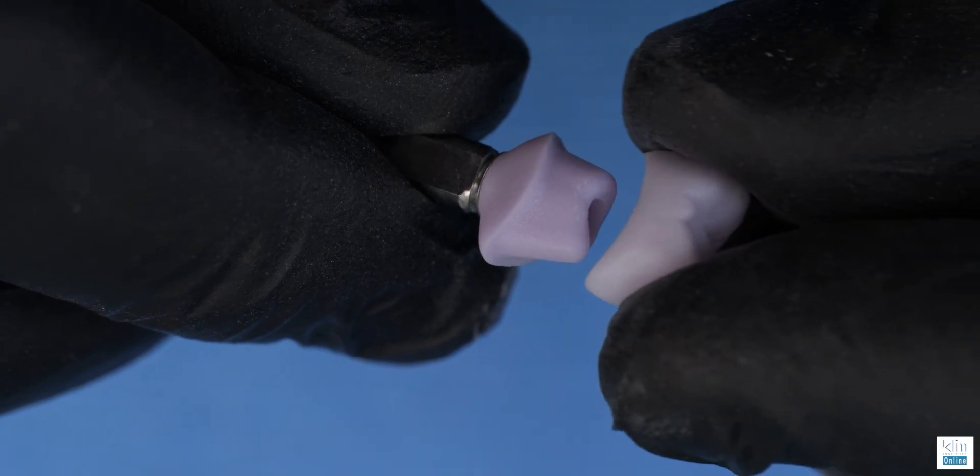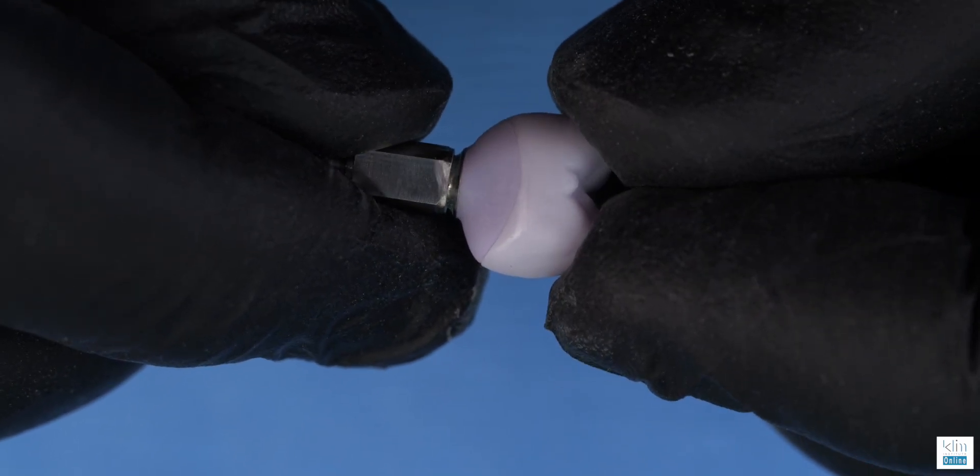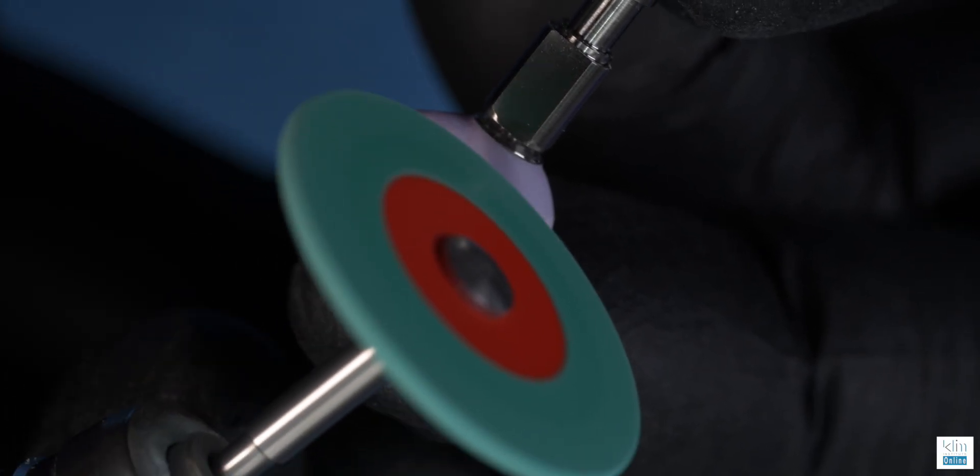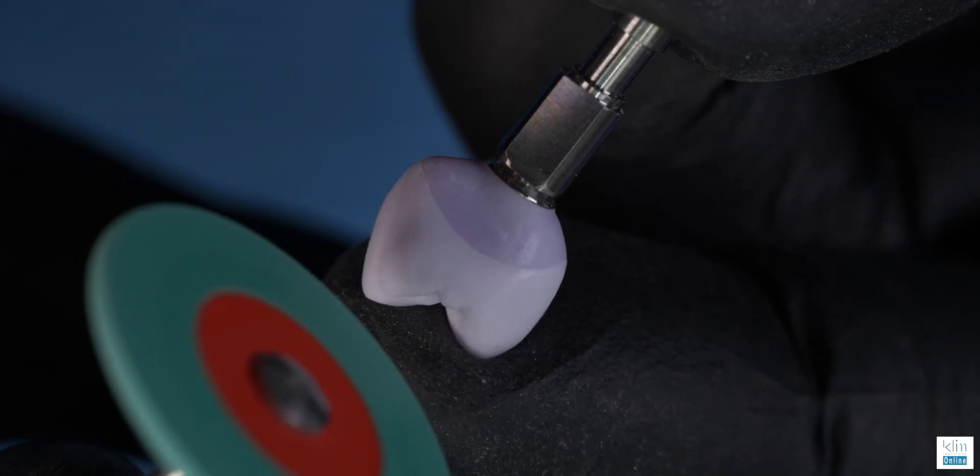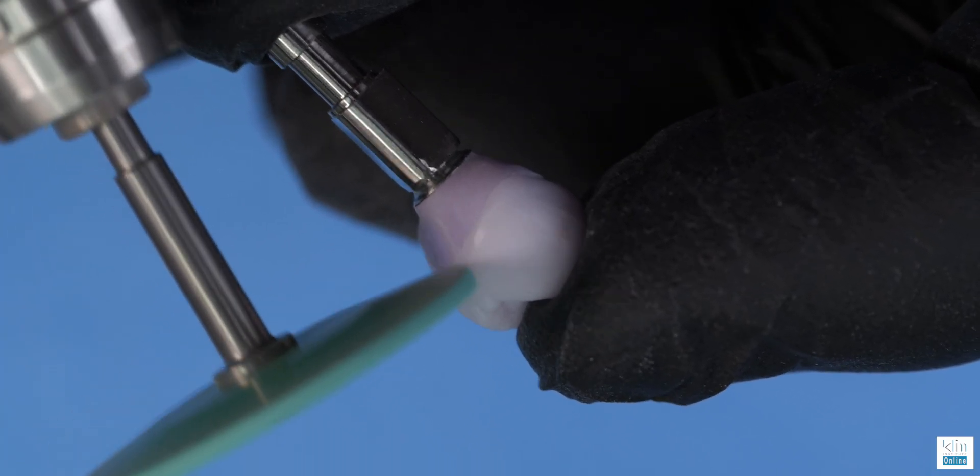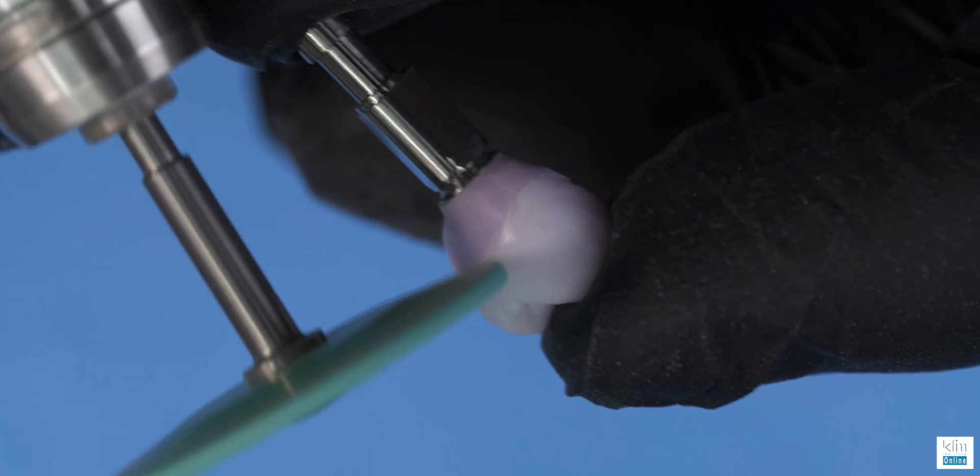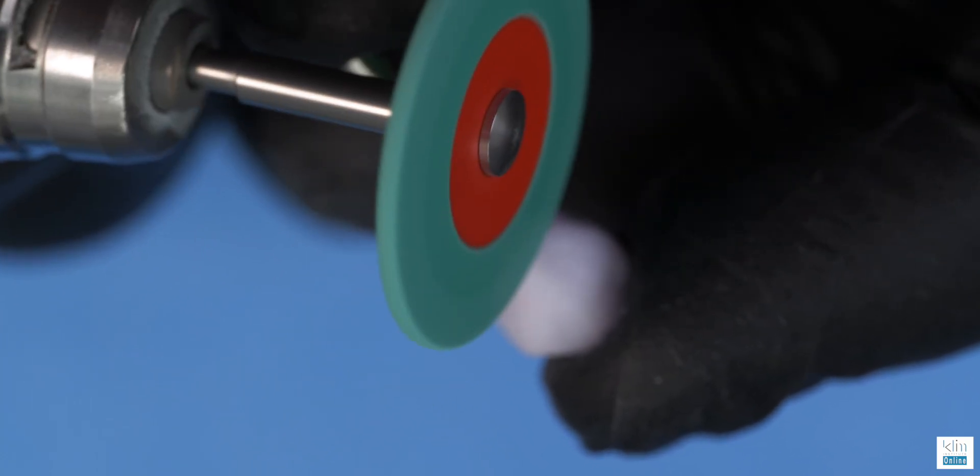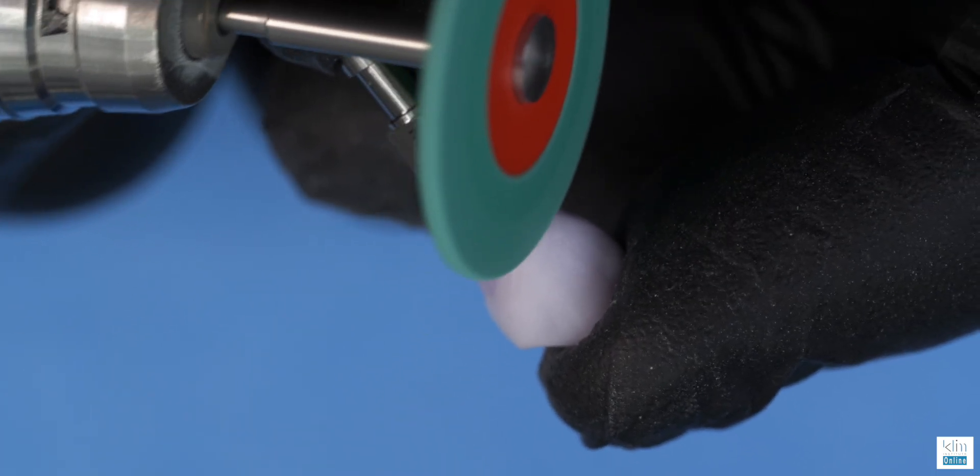With the extra fine mill for Emacs, you can see those margins are nice and tight. We're wanting to verify them in the fit. Take the green coarse wheel, holding that crown tightly onto the abutment and polish that junction. And that will create a glass smooth transition from the abutment to the restoration.